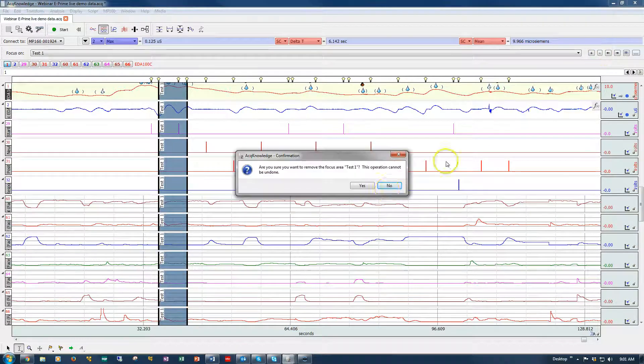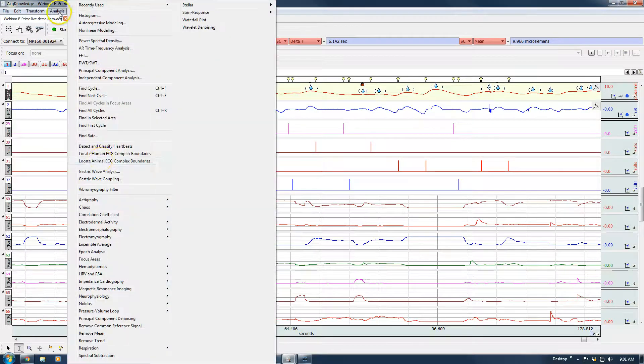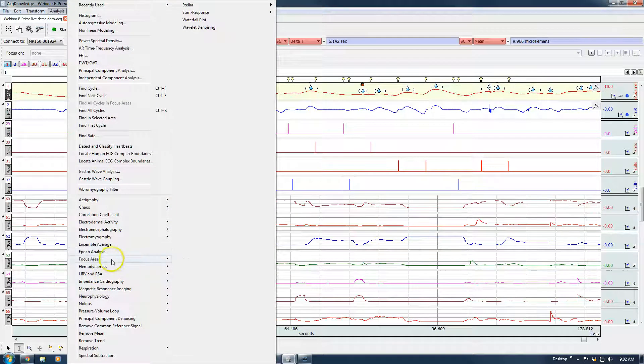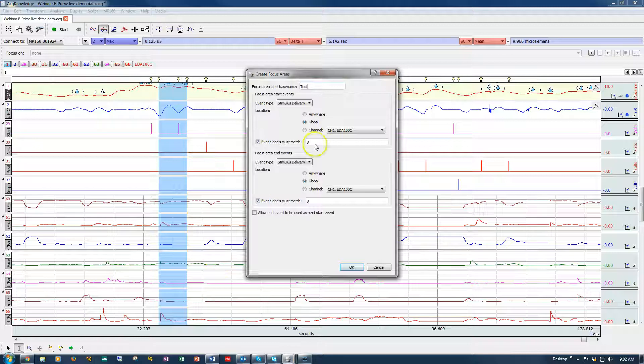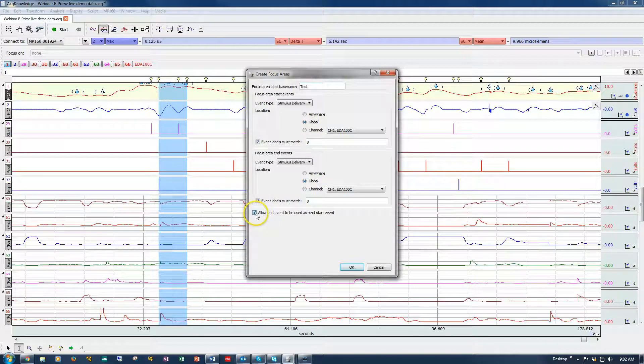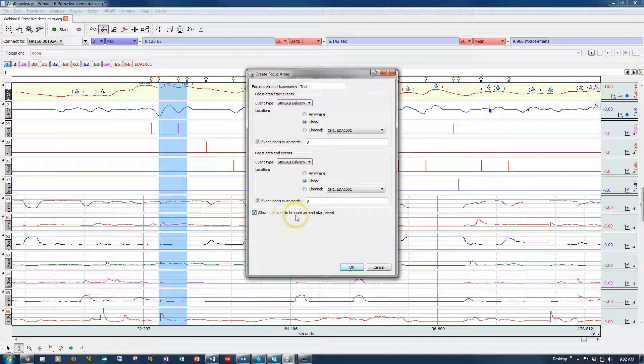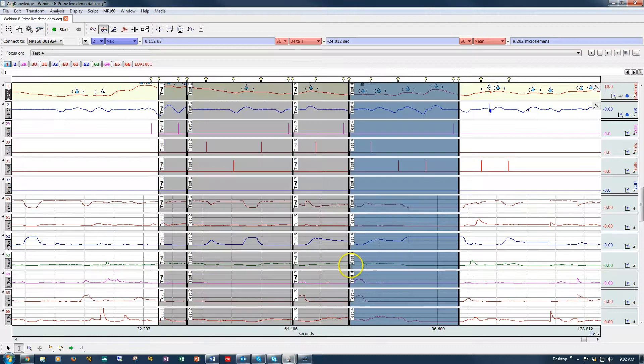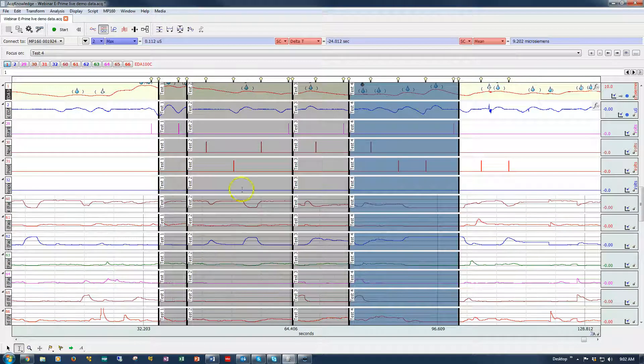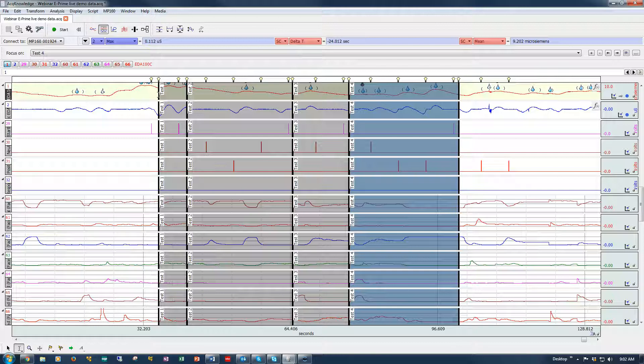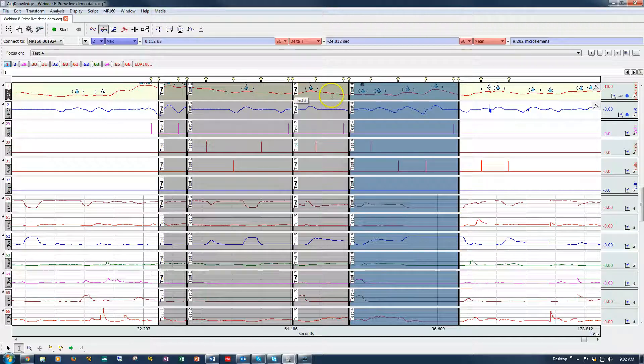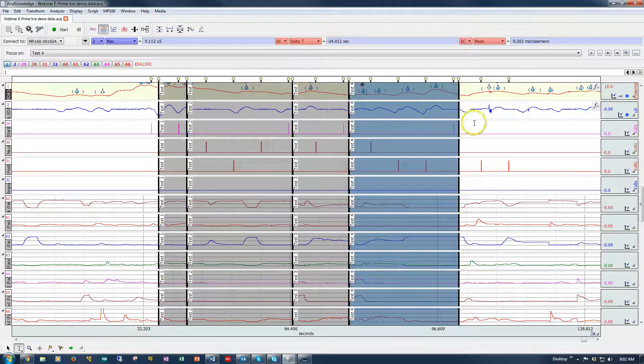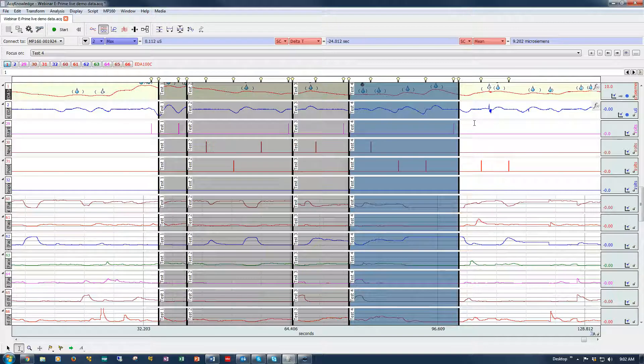If I do the same thing again with the exact same criteria, but I make one subtle change. So we're going between 8 and 8. And this time we're going to allow the end event, so the second 8, to be used as the beginning of the next boundary. And then we get something like this. So we've gone from the first stimulus delivery type 8 to the second. Then we've started again and we've gone from this one to the next one. And then we've started again to the next one to the last one. So you've got a lot of flexibility there in how you create them.